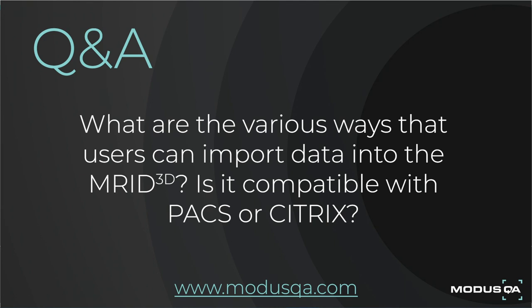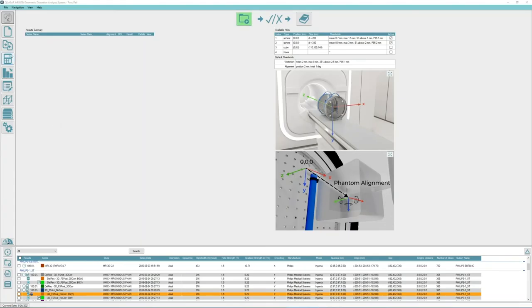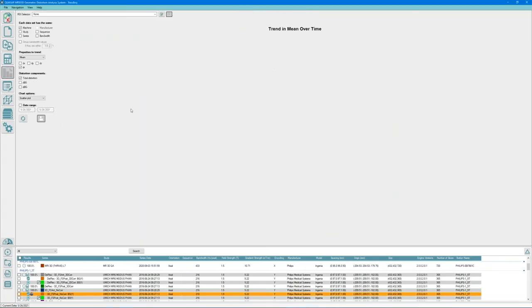The third question is: are all the results stored in the database? Is there a longitudinal view of distortion changes on a particular scanner available? Yes, it is a database, and we do have a trending view. You can look at machines and study series. You can select a number of different data sets to track, set the date range, and charting options as well.